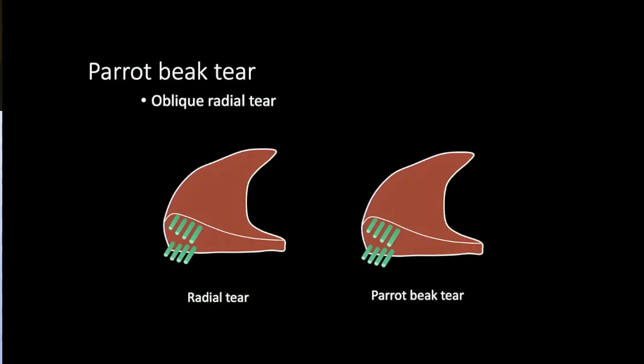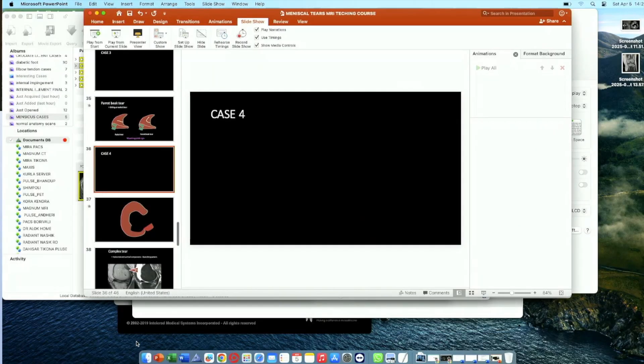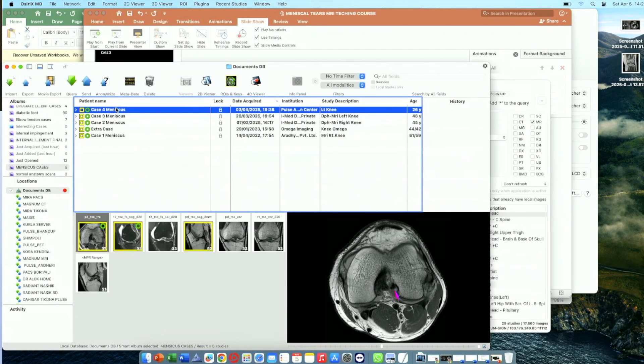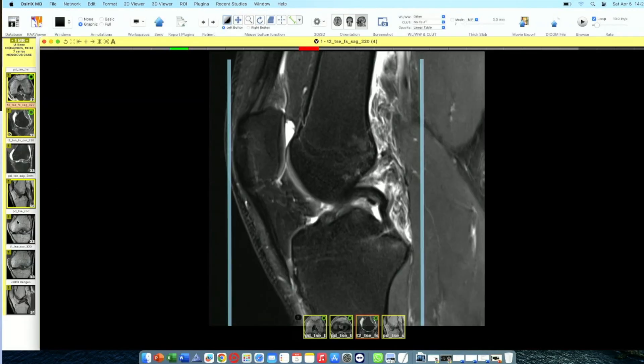To summarize: a parrot beak tear shows a marching cleft sign. If you don't have the axial image, look in the triangular fashion — the signal will move from the apical free margin to the periphery of the meniscus. Let's look at the last case to finish the meniscus session.